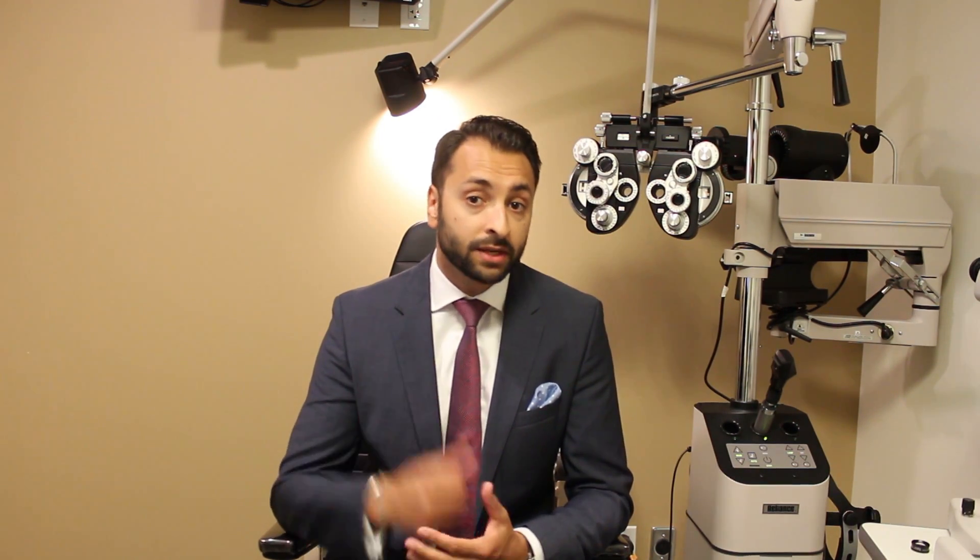Let's go back into the other room and I'll tell you why we do it. We've established that we need to check the pressure in the eyes, and the non-contact tonometer is one way of doing that. But why do we need to know what the pressure is? High pressure in our eyes is a risk factor for glaucoma, which is a disease that affects the optic nerve in the back of the eye. Glaucoma is considered a silent disease because it doesn't affect your central vision, doesn't have any pain associated with it — it really just creeps up by affecting your peripheral vision. Knowing that the pressure in the eye is high is one way for us to look more closely for glaucoma.